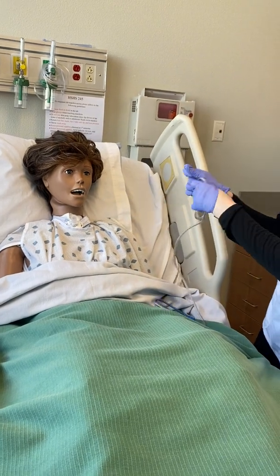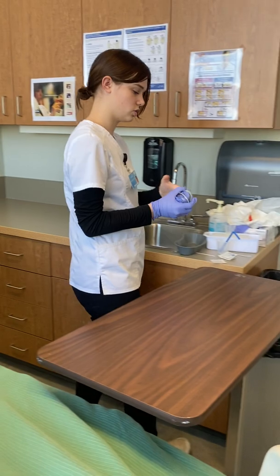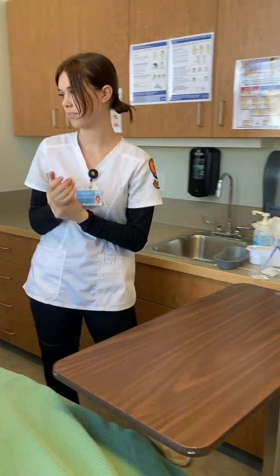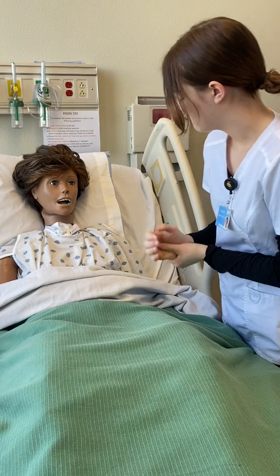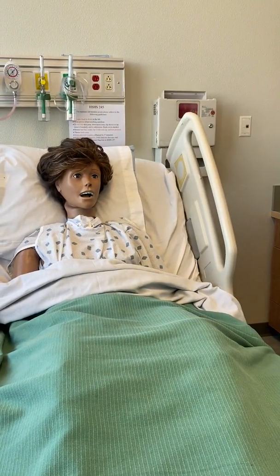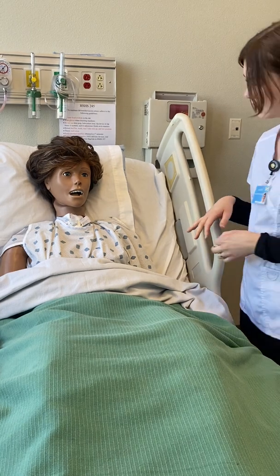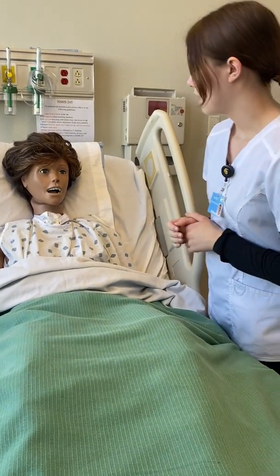All right, how you doing? Is that okay? Just gonna coil that up, making sure to keep it inside of my glove. I'm throwing that away. Gonna wash my hands. All right, how you feeling, okay? I'm just gonna go ahead and look at the inside of your mouth, and then we're gonna provide some more oral mouth care. Make sure everything inside there is clean. And then if they have anything on their nose or anything, I would clean that up as well.